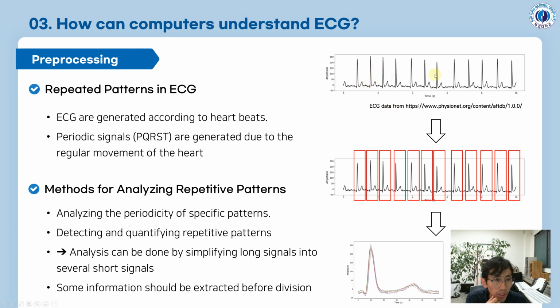And you see there are some intervals between these peaks. We say this is the RR interval. So this highest peak is called the R peak, and the intervals between them are RR intervals. These intervals are not equal, they vary. But they should be similar, not so different.